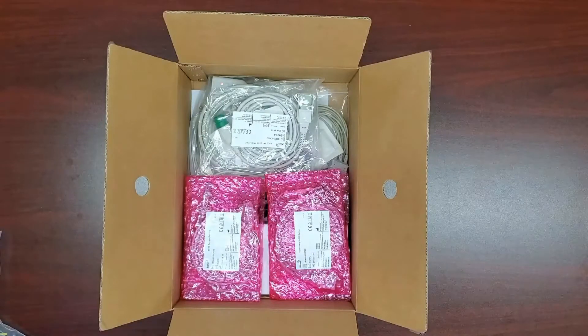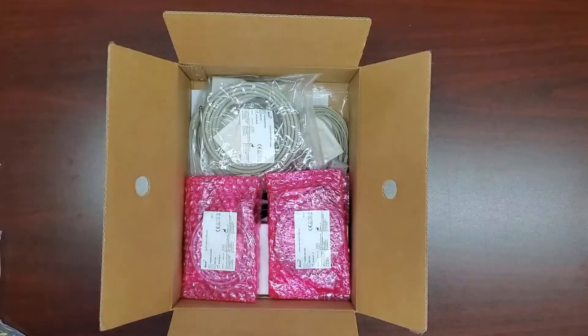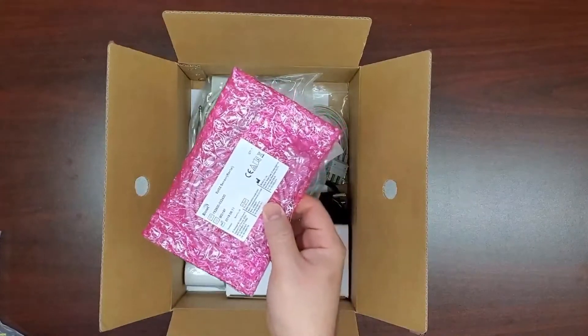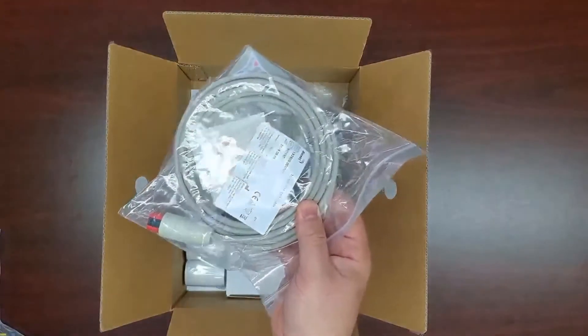Three accessories make up your SpO2 assembly: an extension cable and two different kinds of sensors — both a multi-site clip and a transflectance probe. The ECG assembly is made up of an extension cable and the three-lead ECG cable.